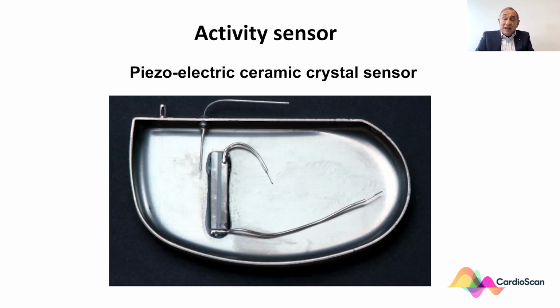Most of you will be familiar with the echocardiograph transducer. It too is a piezoelectric crystal, but the electricity is passed through that crystal when we are using it for echocardiographs and ultrasound, and then the vibration returns as ultrasound to the machine, and as a result of this, which is exactly the opposite, it too can be used, but now for opposite reasons to what we use in the activity sensor.